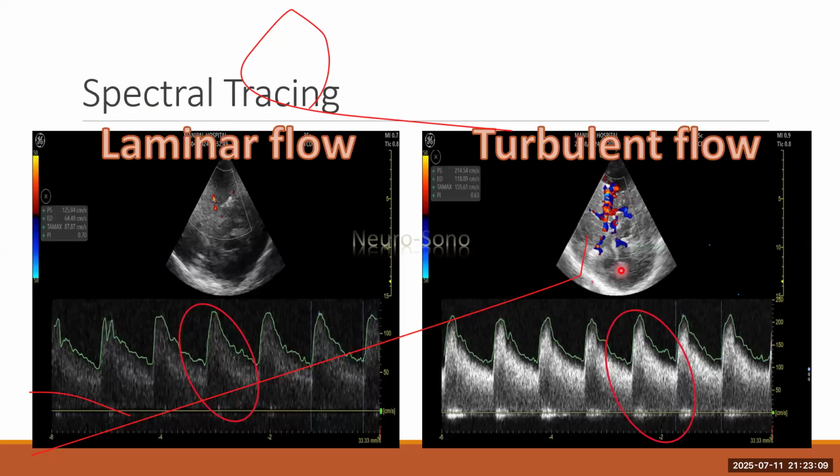This patient had an MCA aneurysm and was coiled. The turbulence we are getting here is possibly secondary to the coil, though that is retrospective thinking, or it could have been due to flow-mediated hyperemia and stenotic phenomena. If we see here, the TAMAX is 155, which comes into the mild to moderate category. But the pulsatility index is 0.63. So the pulsatility index is low in vasospasm.